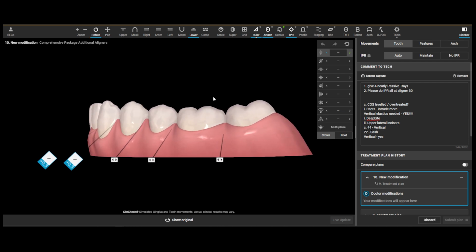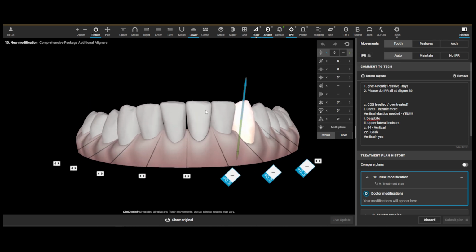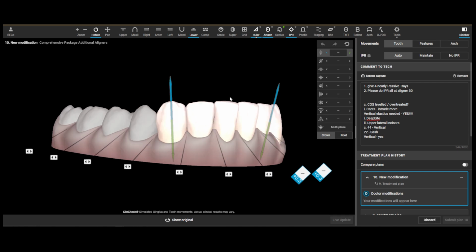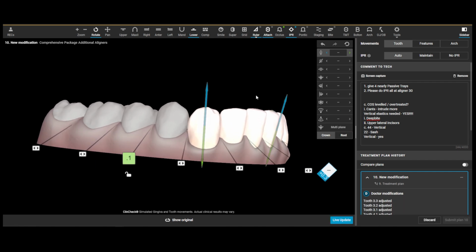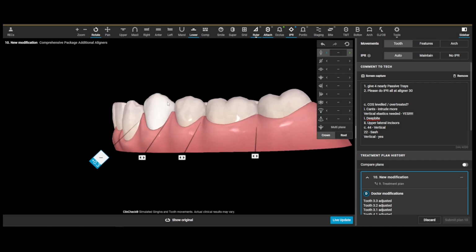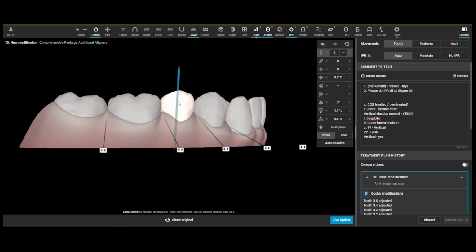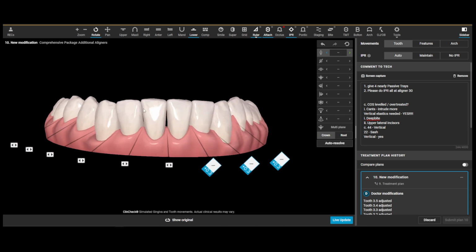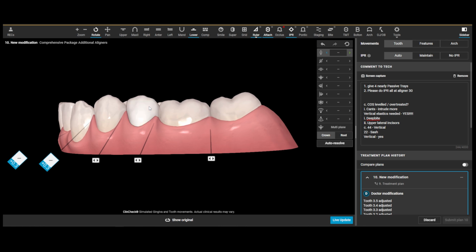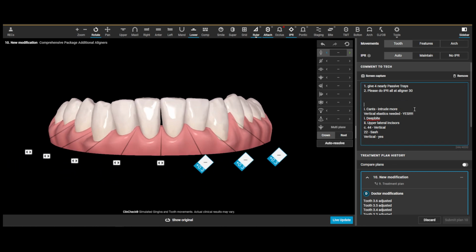Now, everything here at the end is pretty much all perfectly set up, but I would be able to grab using the tooth feature here, these anterior teeth for our curve of Spee, and I can go ahead and intrude them more. I'm just pushing them down into the bone a little bit more. I can extrude those premolars. So if I'm doing a bit of a reverse curve of Spee, I might show something that looks like this on our plan that just shows the anterior teeth more intruded than not. It's over intruded. So that's how you would over treat the curve of Spee.